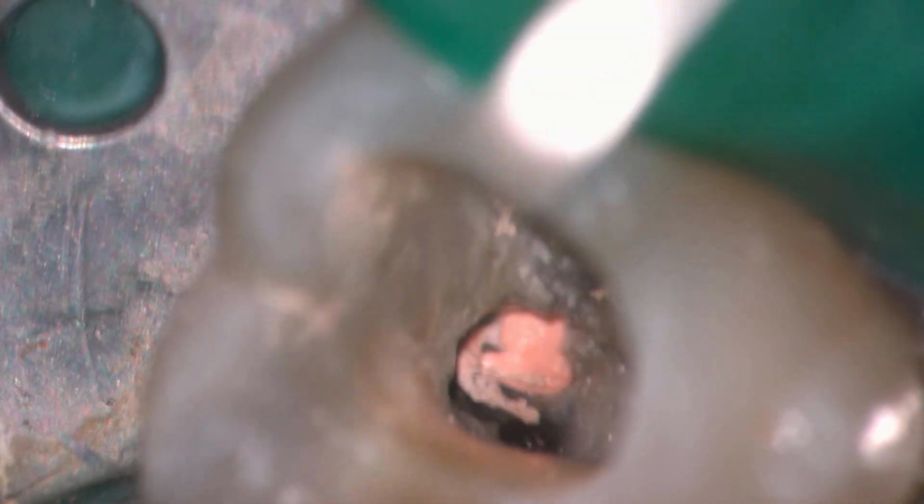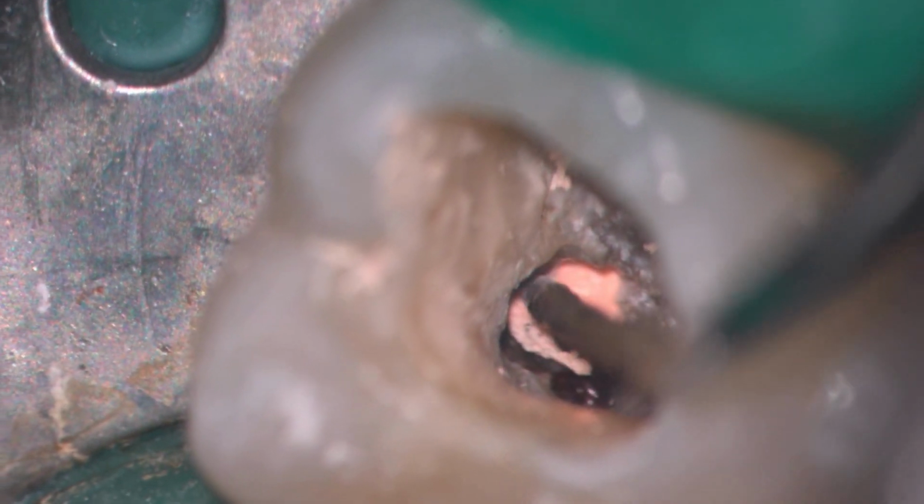Now that it's a little bit hard, it's not gooey, from the couple rinses of alcohol, we'll be able to pick that clean. I'll use several different fine instruments, including an explorer, and just scrape that around and remove it so it's clear.